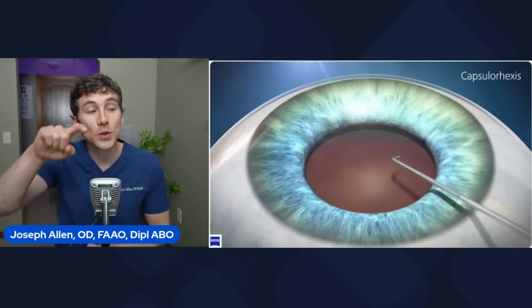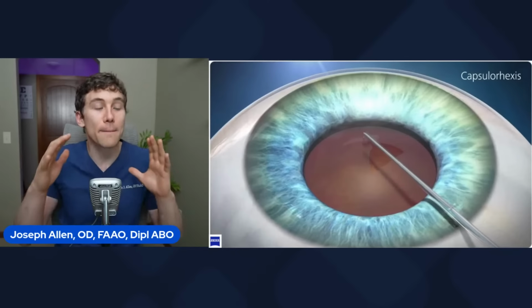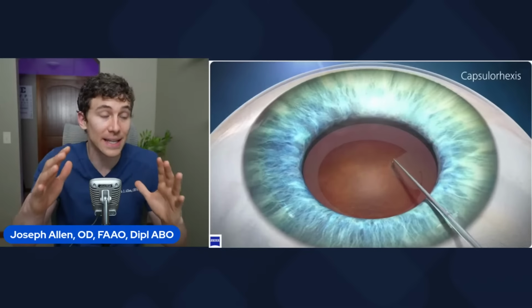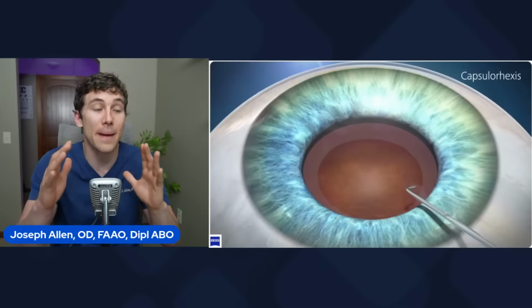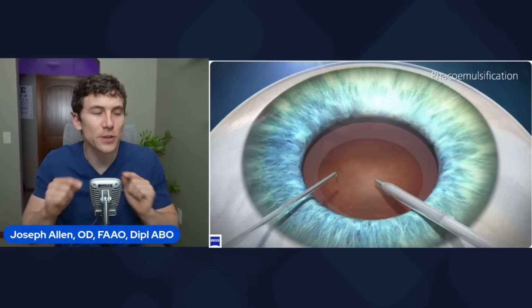Your surgeon would use this little hook to create a small opening on a bag that holds the cataract, because inside of our eye, the lens and the cataract is inside of a clear membrane bag. And they have to create a hole in that. So they make a perfect circle.